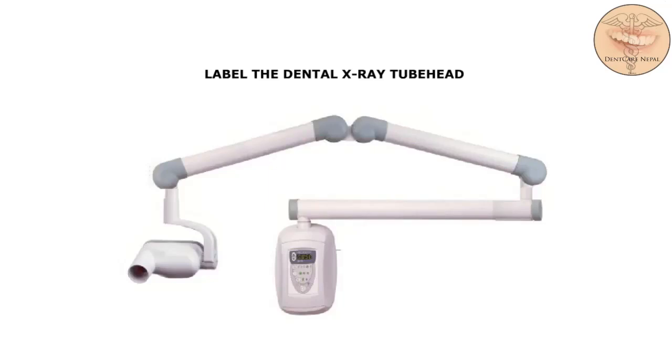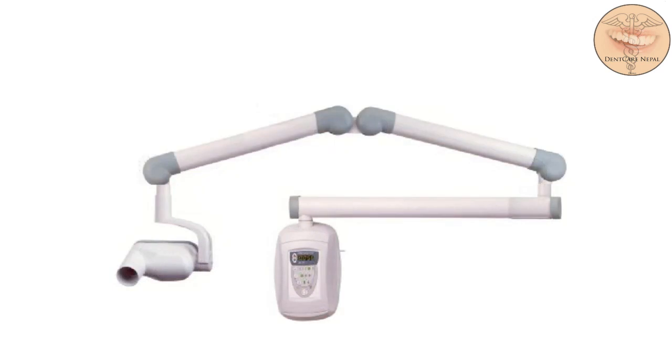Label the dental x-ray tube head. The tube head is a sealed heavy metal housing that contains the x-ray tube that produces dental x-rays. A tube head part name and its definition will appear on the screen, and we're going to click on the part name and drag it to the correct location on the diagram.